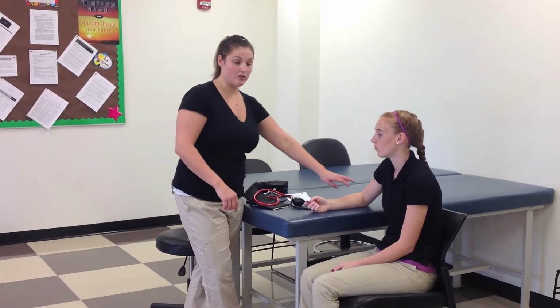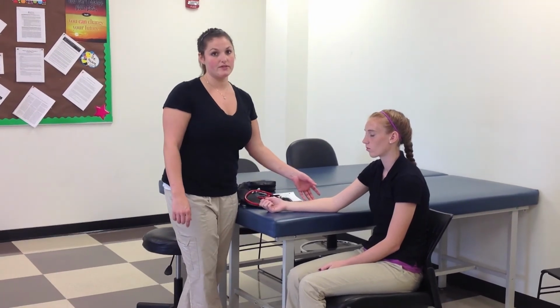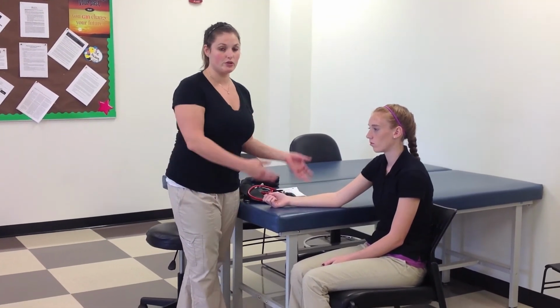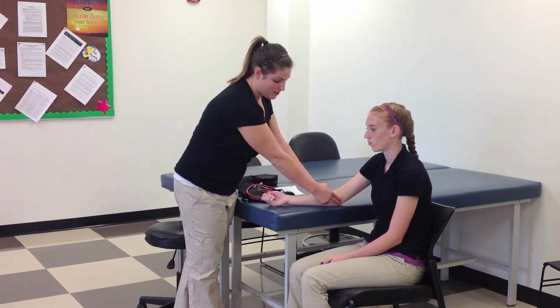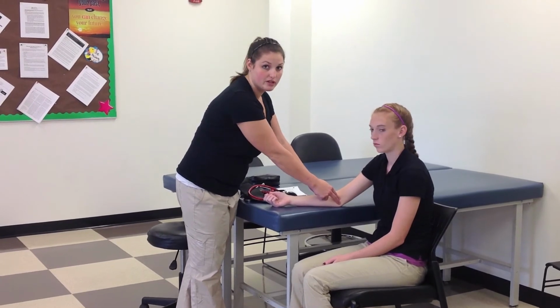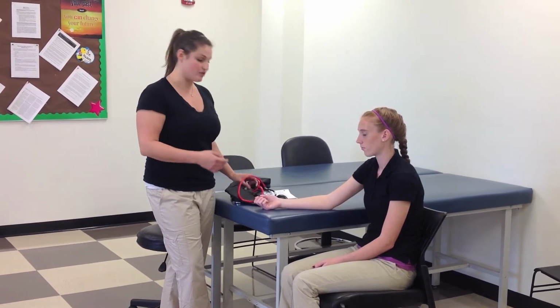Okay, when taking someone's blood pressure, you need to start by exposing their antecubital part of their arm right here. So this is pretty easy because she has short sleeves on, but if she has longer sleeves, then you'd roll her sleeves up and make sure there's not too much pressure on the arm. If you're able to, you can palpate the brachial artery to know where you need to place the stethoscope on the arm. Some people can't, so it just depends on practice and your ability.